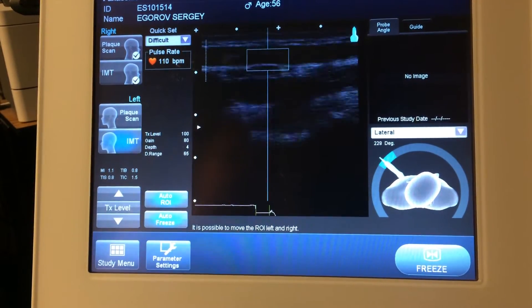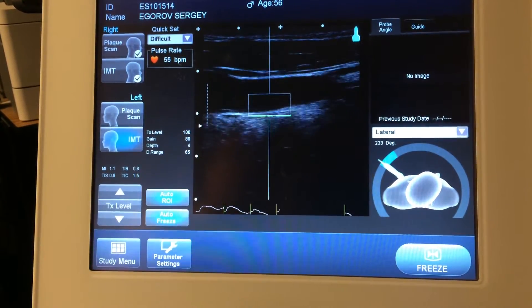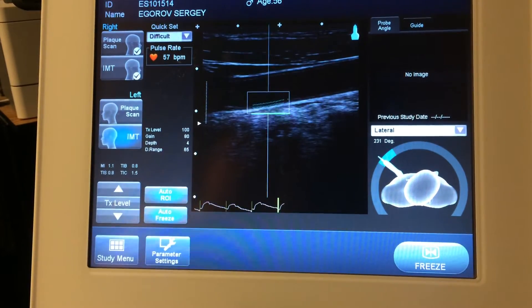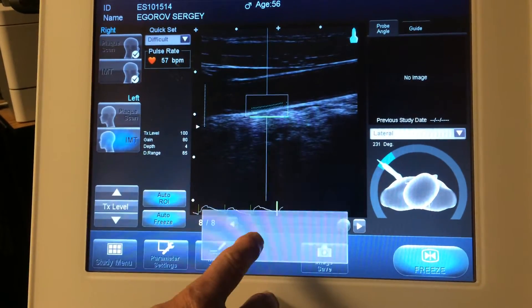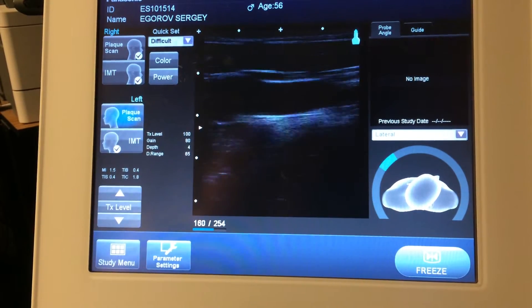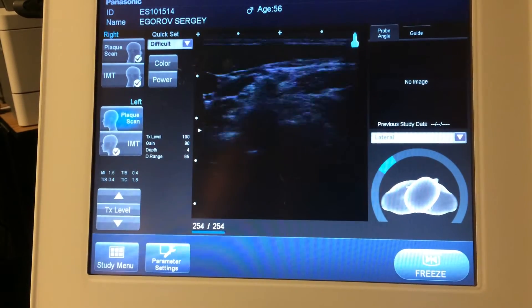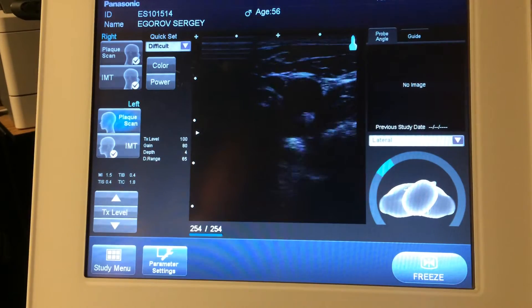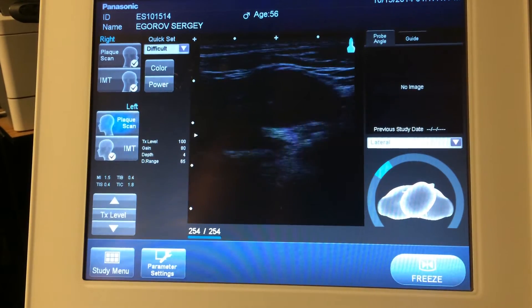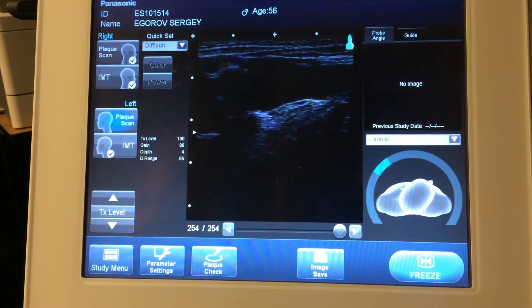So first we'll do the wall thickness measurement on this side. This side it's not bouncing around so much, so it should be a little bit easier. And then we'll make sure there's no plaque on this side. Look at that bifurcation point — it looks nice and clean. Looks very good. So we'll go ahead and take a picture of that and save it.